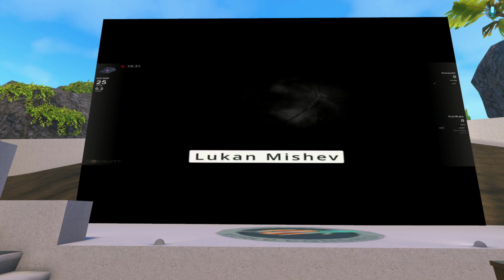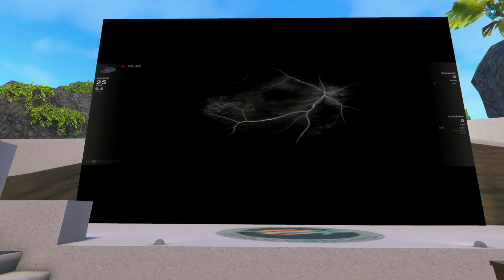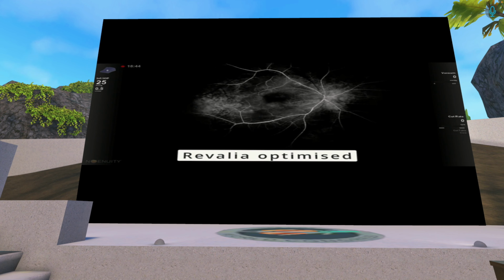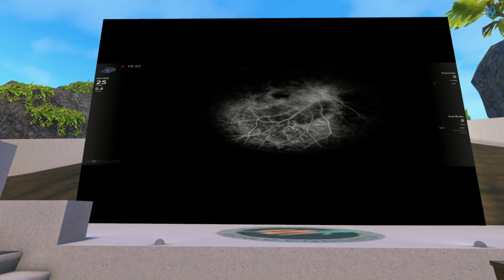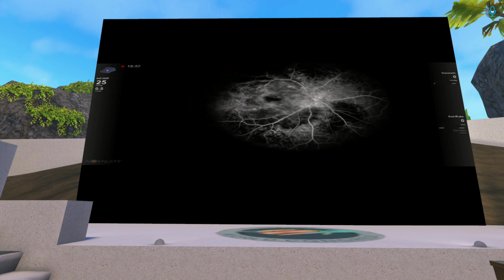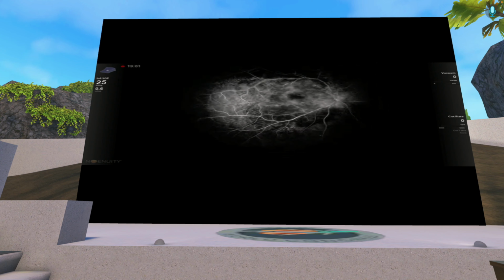This is a case where there was a hemophthalmos due to advanced age-related macular degeneration. And the filter that I'm using is optimized actually for the Revalia microscope, because since I play a lot with these filters, I realized that the spectral transmittance of systems like Alcon and Zeiss are actually different, and it relates to the contrast of the image that we might have.